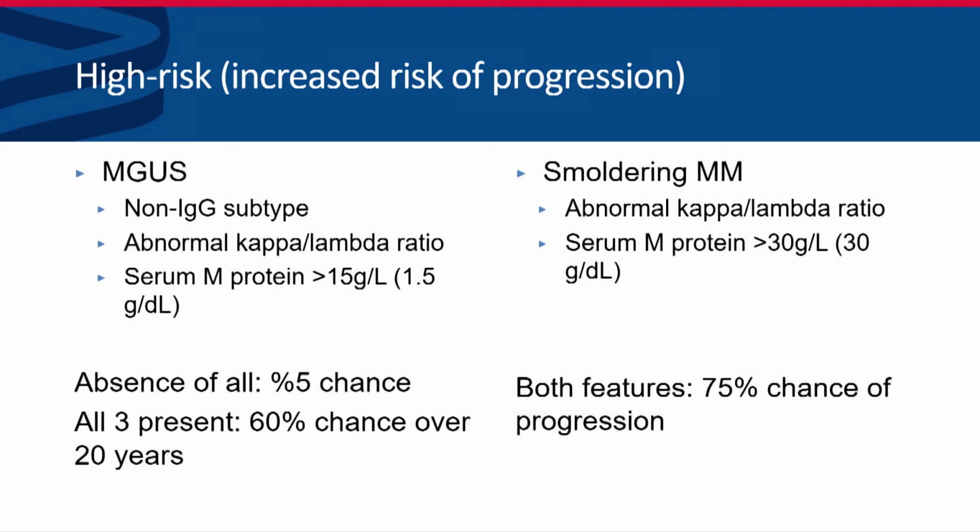If someone's actually progressing from a band of 1 gram per litre, then goes to 5 grams per litre and 10 grams per litre, that disease is clearly moving on and it's appropriate to refer that patient. If it's stayed at 1 gram, and it was 1 gram last year and 1 gram the year before, that disease is not going anywhere. It's not causing any problems. If it causes symptoms, then that's reasonable. The gram might not change much, but if they've got unexplained symptoms that put you down that path, then it's reasonable to refer for further investigation should they need it.